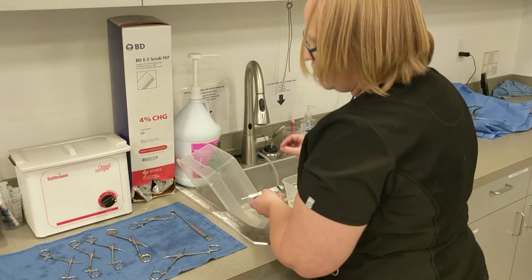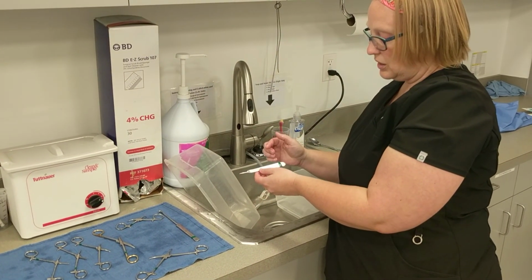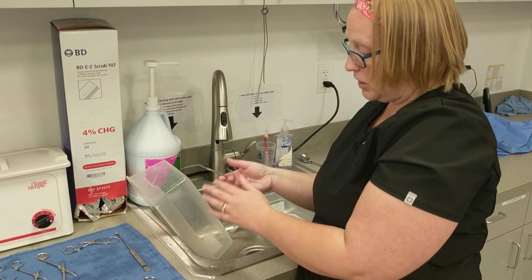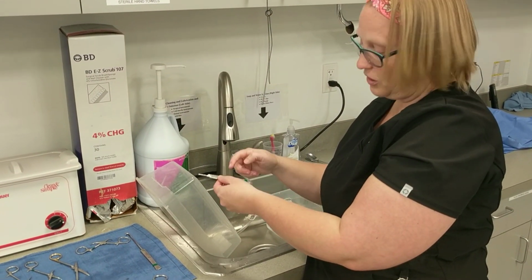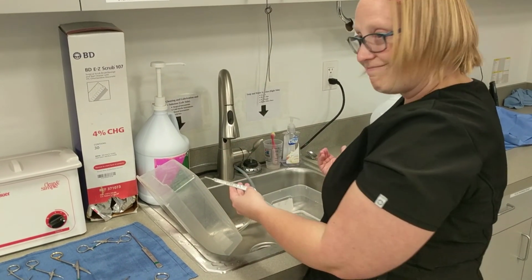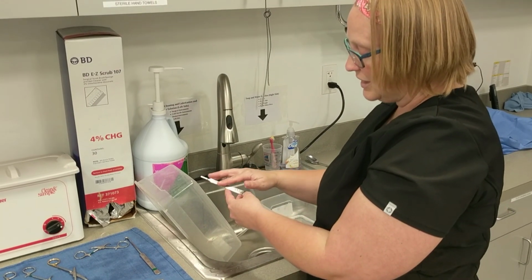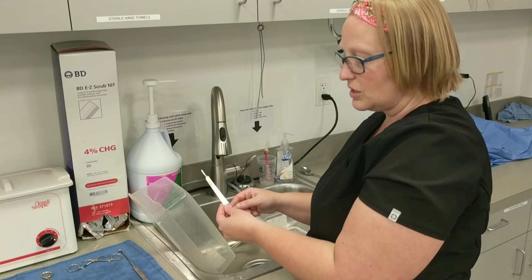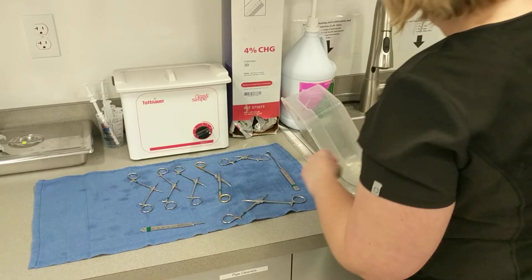One thing I've noticed, especially when training new technicians, is that they don't look at the handles. This happens to be the blade holder. Sometimes you'll find thumbprints across here. This is a measuring tool as well. Sometimes if those thumbprints get on here, you get debris, any stains, things like that on this, then those measurements become a little harder to see. So we're going to set that right there.